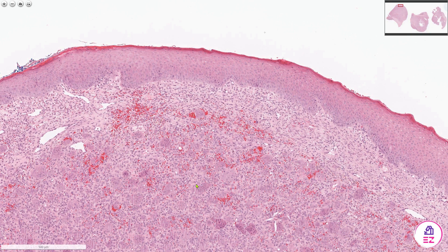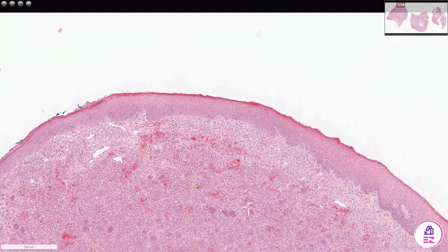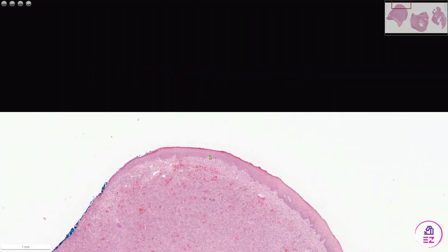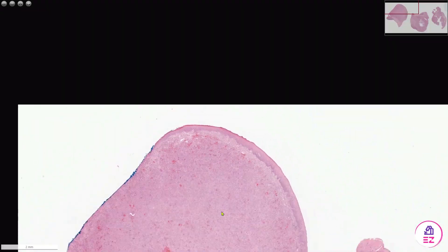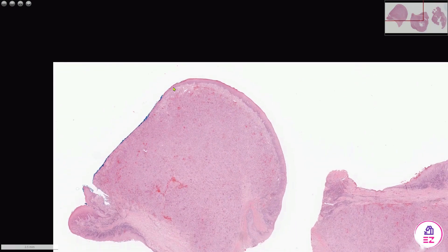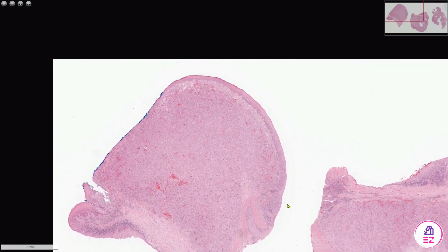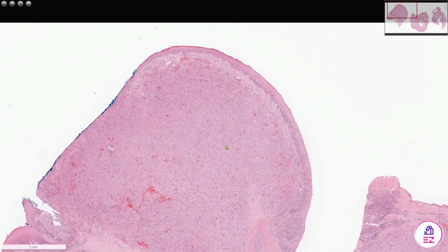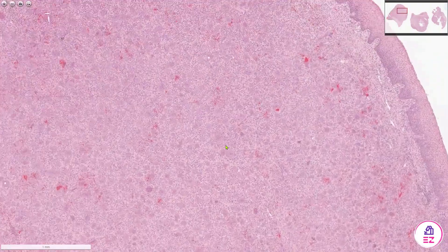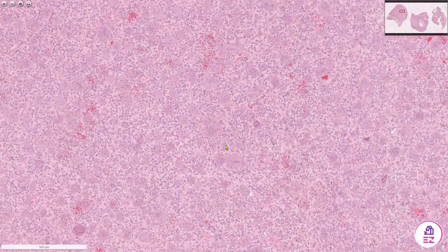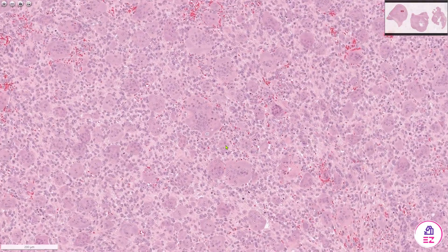This biopsy is from the gingivae and if we zoom out you can see that the lesion has a somewhat nodular outline, so this would have appeared as a swelling or epulis on the gum.